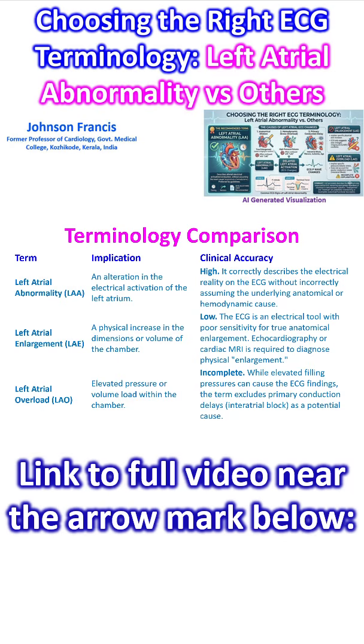Left atrial enlargement: the implication is a physical increase in the dimensions or volume of the chamber. The clinical accuracy is low. The ECG is an electrical tool with poor sensitivity for true anatomical enlargement. Echocardiography or cardiac MRI is required to diagnose physical enlargement.